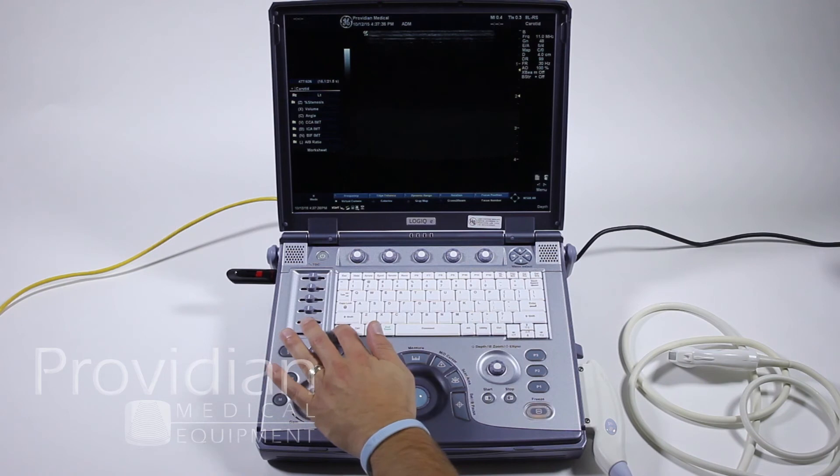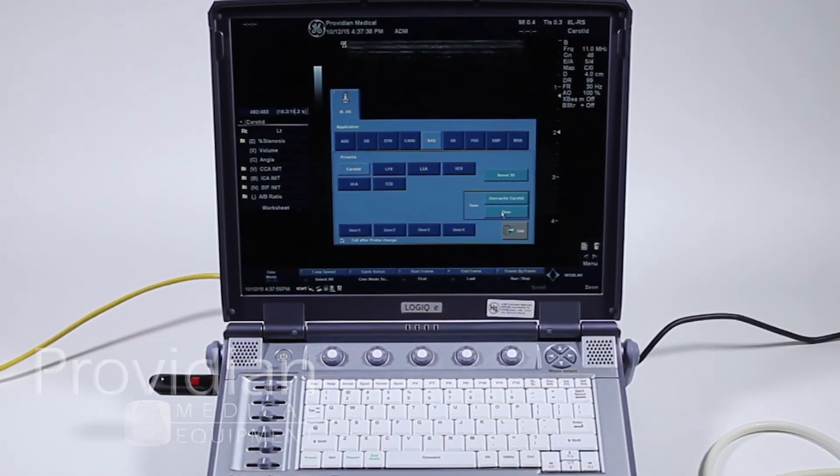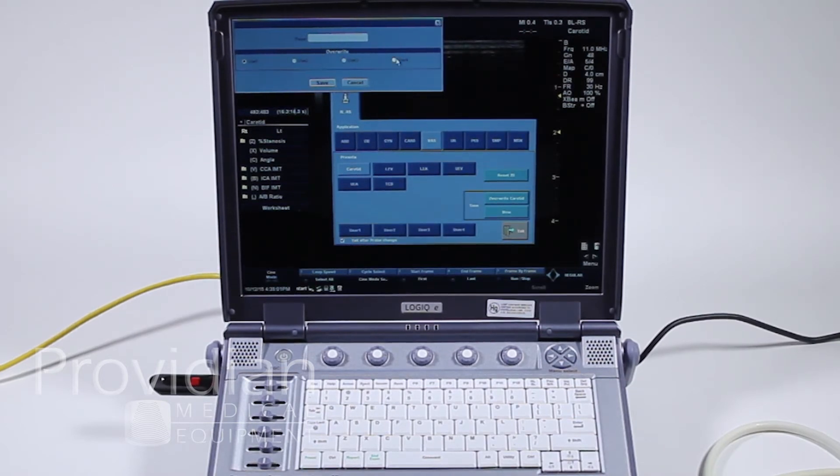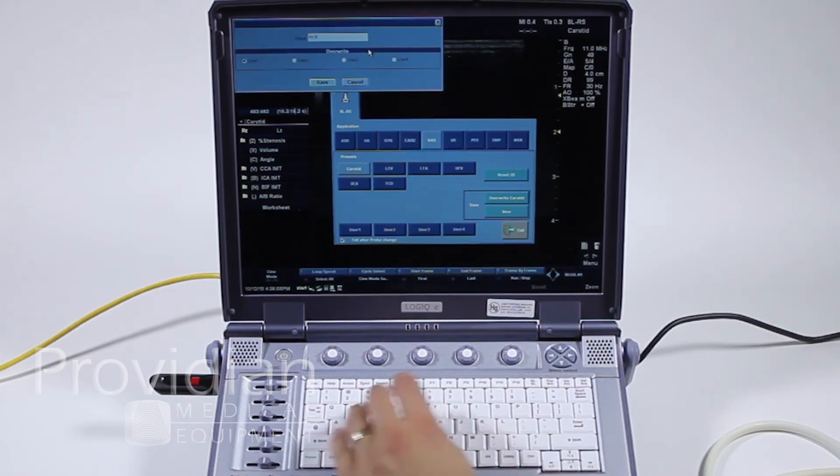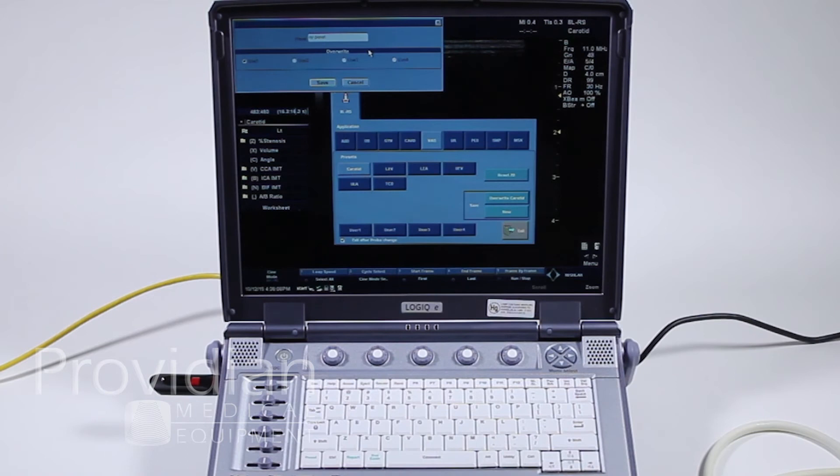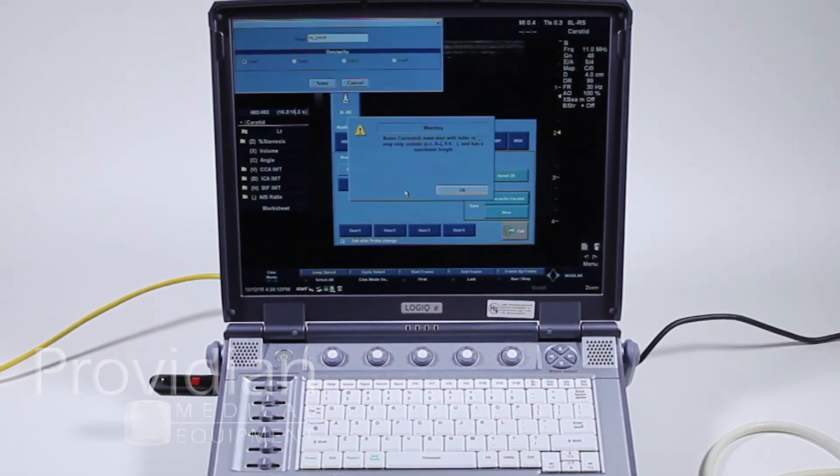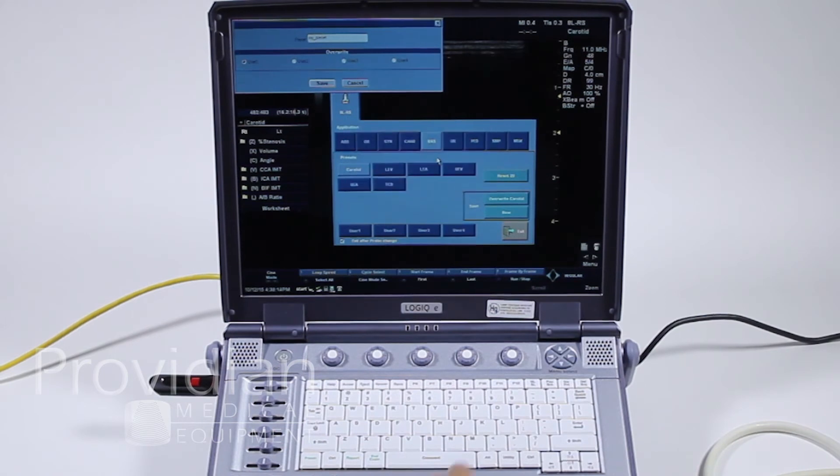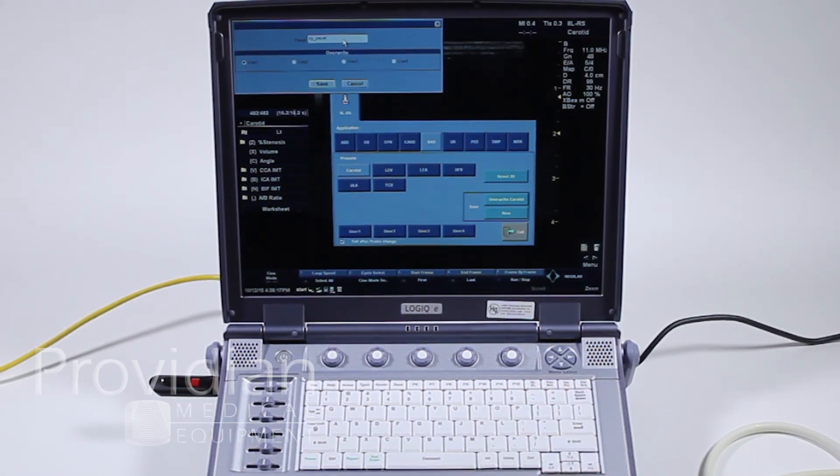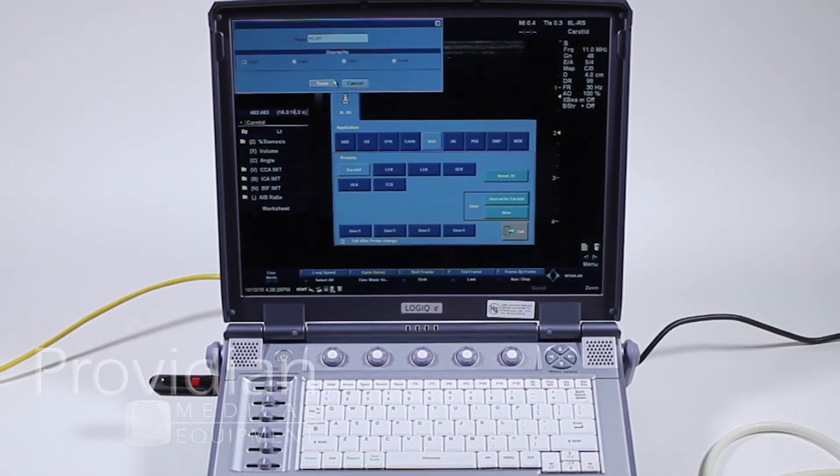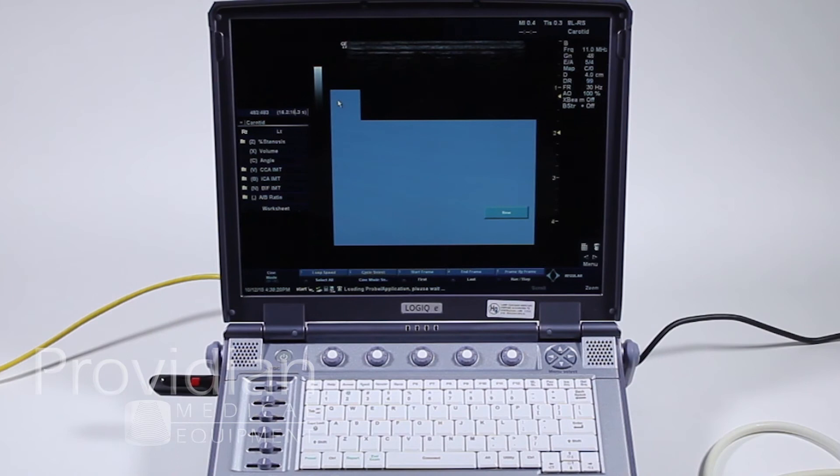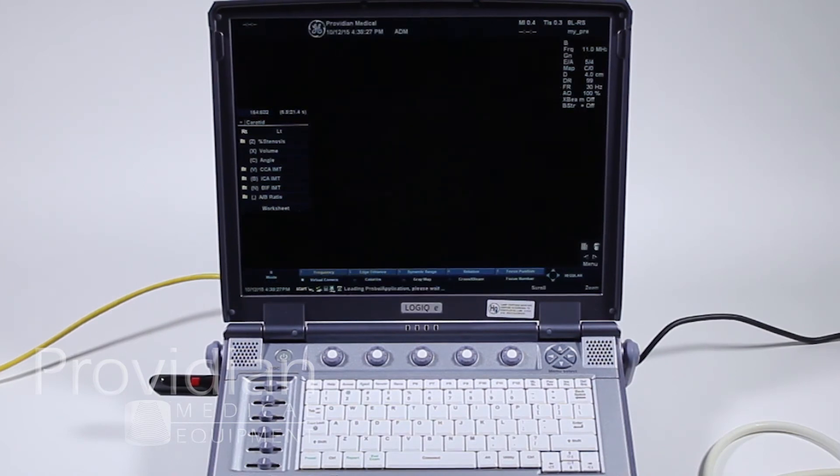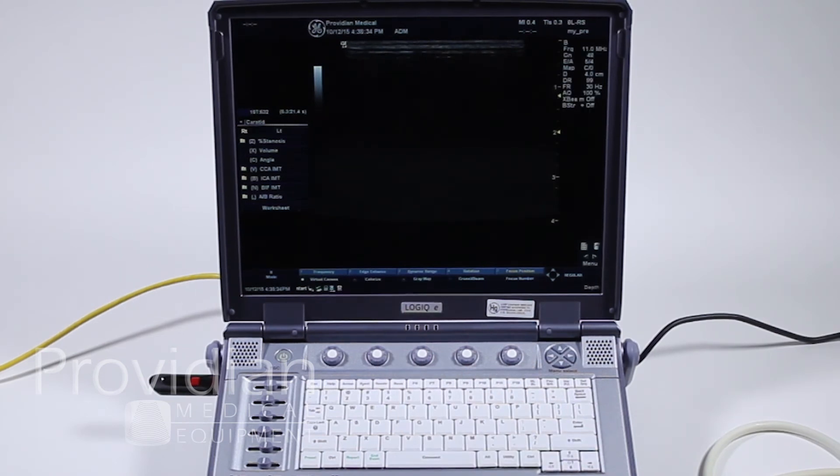I'll let that go away. And then I can just click preset. You can come over here and click new. And it's going to say, which one do you want? User one, user two, user three, or user four. And you can put in a name, my preset. Usually for multiple user situations, people will put their own names on it. I put too many characters in there. There is a limit as to how many characters. I have no idea what it is, but I'll just call it my pre. Click OK. And here it appears down here. So whenever I go into that vascular preset, all those changes I made will come up every single time. So I don't have to keep making those changes each time.